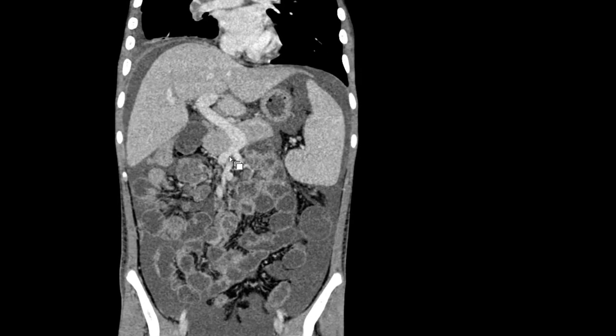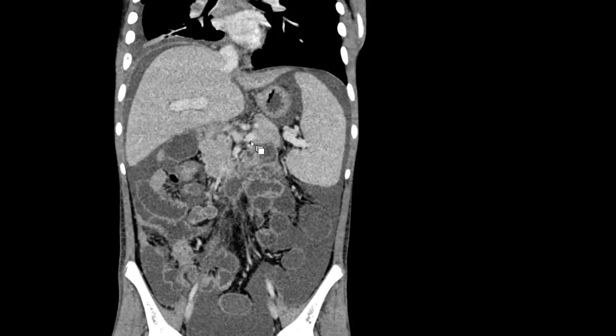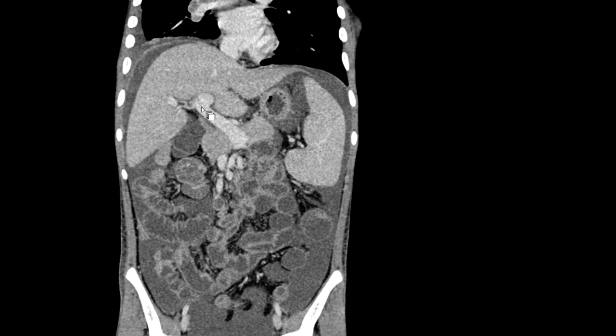So the superior mesenteric vein has confluenced with the splenic vein to form the portal vein, and the level at which the portal vein enters into the liver, we have to stop at that level. And then in the midclavicular line, you have to measure the maximum craniocaudal size of the liver. So that is 13.6 in this case, so liver is not enlarged.